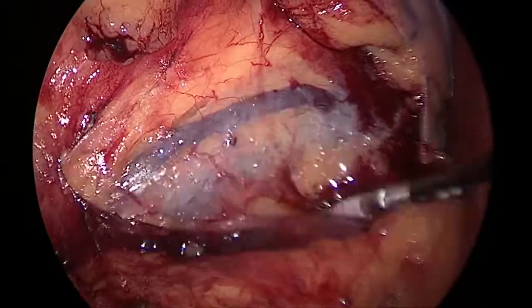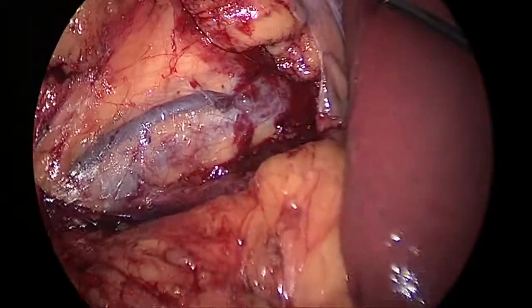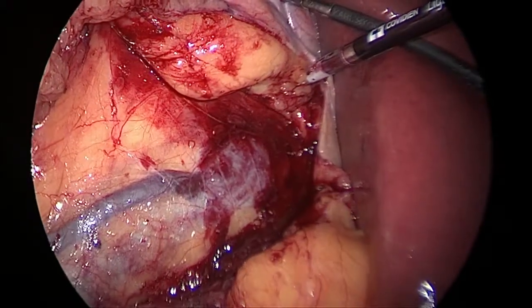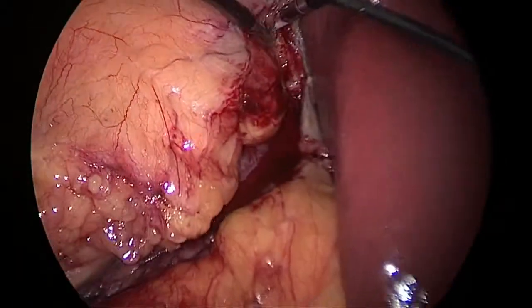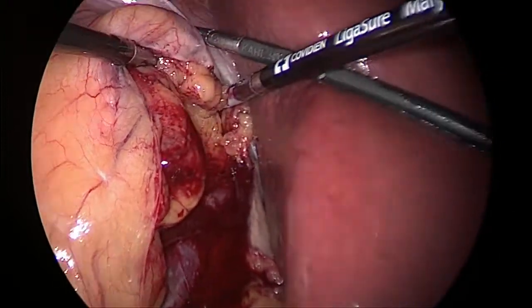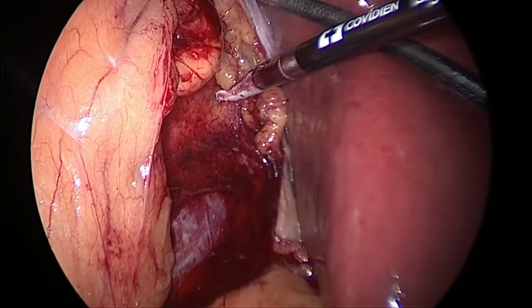But usually we do not directly dissect into the hilum. We try to elevate the gonadoureteral complex, following the psoas major muscle along the lateral border of the IVC. We reach the hilum and we try to dissect the hilar vessels.